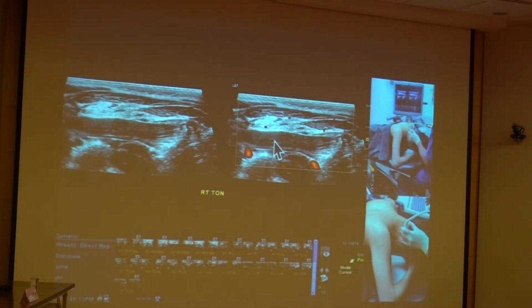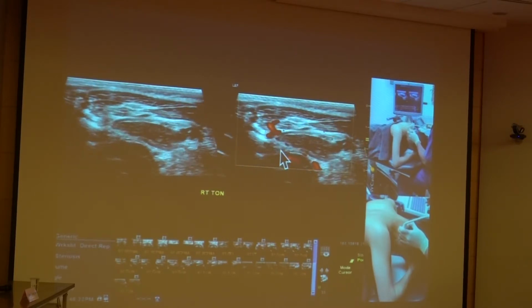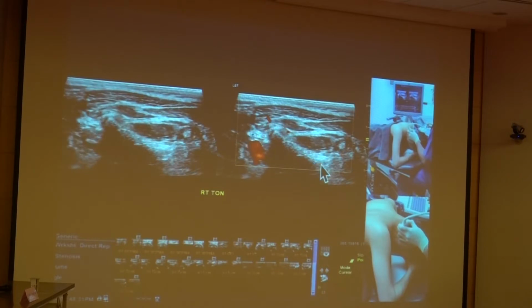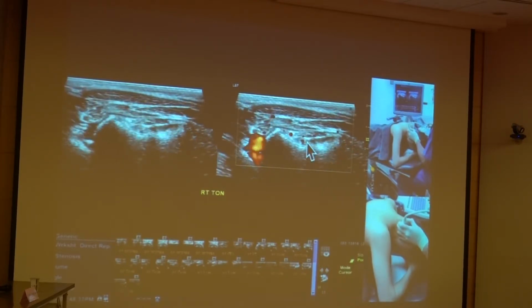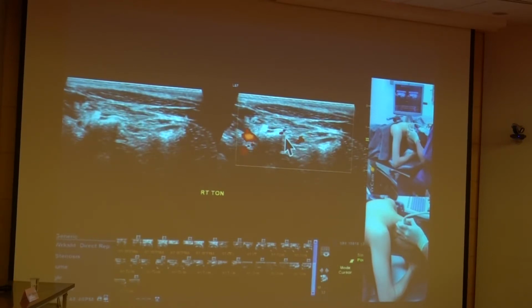This is pretty much the same. From the GON, I turn to the long axis. You can see that it's wrapping around from C2 and going up, and this is the artery going together with the third occipital nerve, and now it goes caudal to that OCI. Now you're seeing the C2-3 facet, and this is the deep cervical artery really, and there's the ascending cervical artery on the lateral side and the deep cervical artery on the medial side.